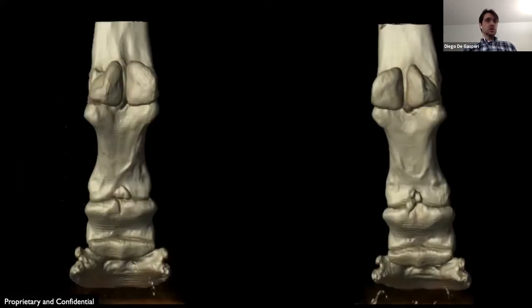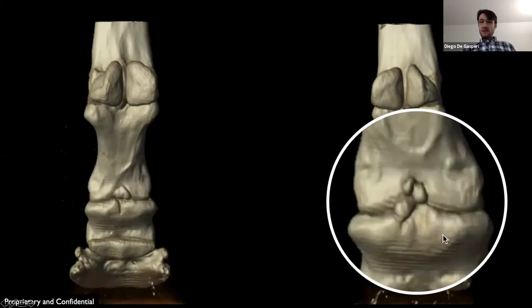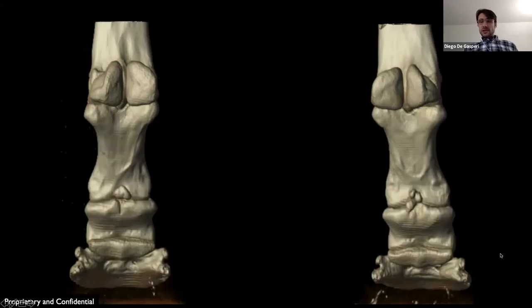This is a 3D reconstruction of both front distal limbs, and you see there's a large fragment on the left and multiple fragments on the right. The decision was made to surgically address the lesion in the right forelimb, since there was no lameness associated with the left forelimb. Arthroscopy was performed in the palmar pouch on the right front pastern joint, and two of these 3 large bone fragments were identified. We were able to visualize only 2 of those fragments. The debridement was performed, and the horse did very well after surgery.